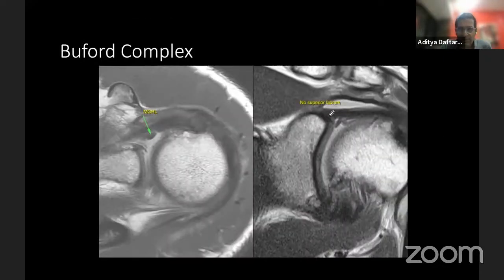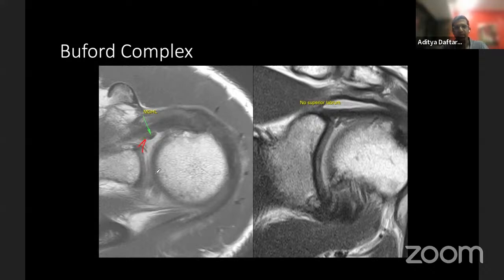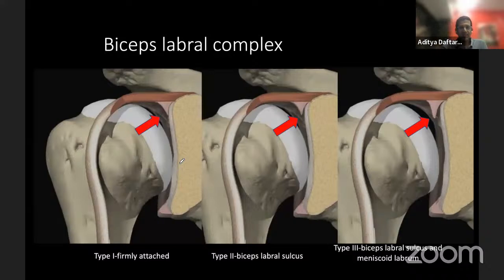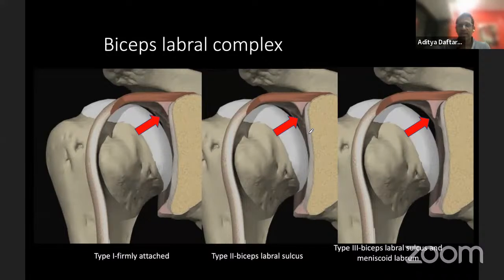The Buford complex is where you have an absent anterior superior labrum — there's no labrum in that portion — but you have a thickened middle glenohumeral ligament. On coronal images, the triangular structure of the anterior superior labrum is missing, but you see this thickened middle glenohumeral ligament. Regarding variations on the biceps labral complex, you can have the biceps tendon with the labrum and articular cartilage, sometimes hanging off, which is a normal type two biceps labral sulcus. When the labrum is much bigger and hanging off even more, you get a meniscoid labrum.